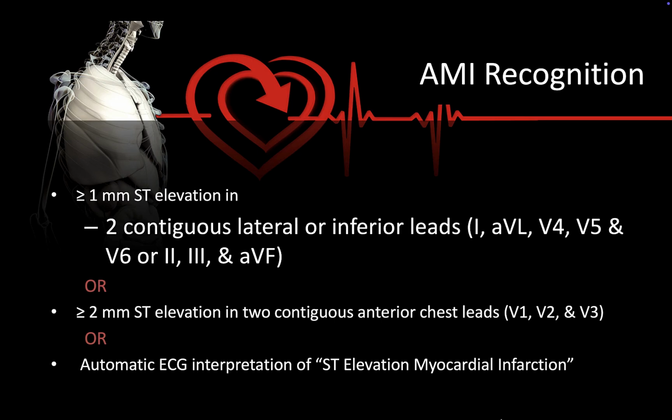And finally, many of our cardiac machines, especially the monitor defibrillators being used in the field today, have machine diagnostics built into them. They do an interpretation. They give you a printout. And if the machine tells you that your patient is having a STEMI, in many systems that's enough criteria by itself to be a straight trip to the cath lab, to be a cath lab activation. In some systems, however, that's not alone sufficient because the machines are not foolproof and there is a margin of error. So my advice, which I'll repeat in a later video, is trust but verify. Take advantage of the machine's ability to spot something that you may not, but look for yourself and verify that those findings are consistent with your interpretation as well.